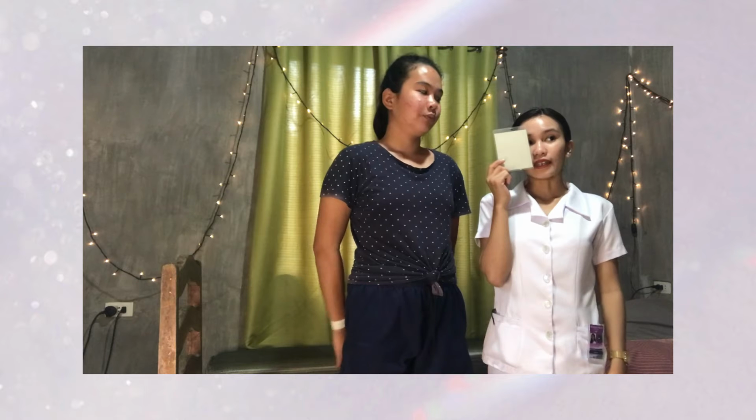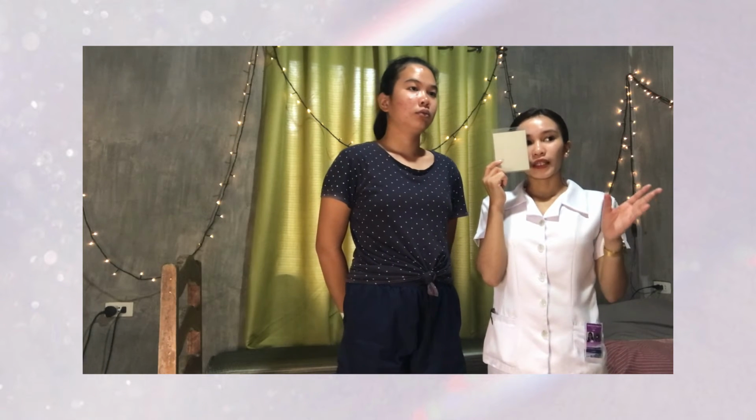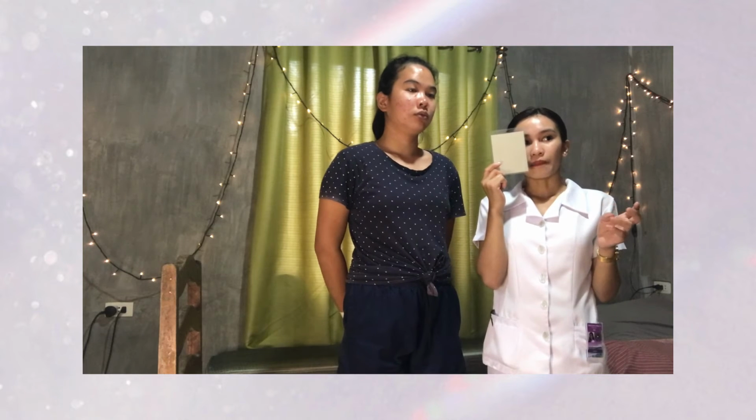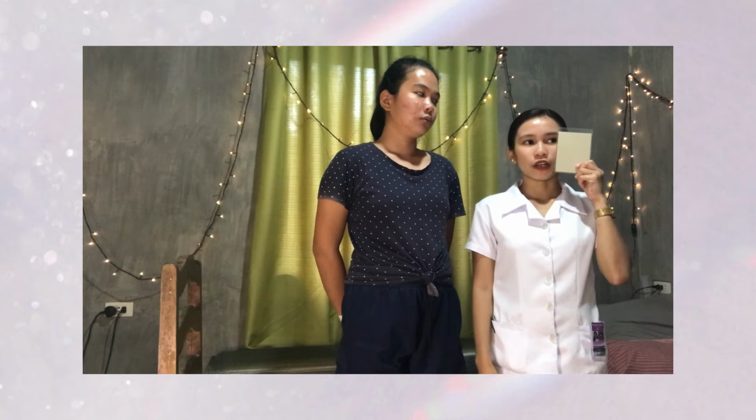Okay, so what I need you to do is use the occluder card to cover your right eye first and read the letters on the Snellen chart, up until the letter that you can still see, okay? And then after doing that with your right eye, uncover it. Then you have to do it again with your left eye covered.